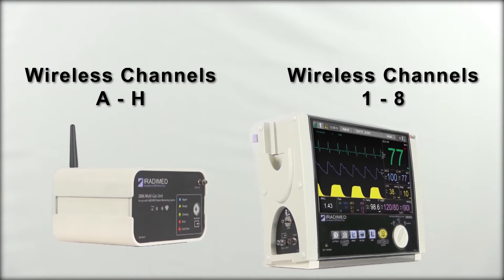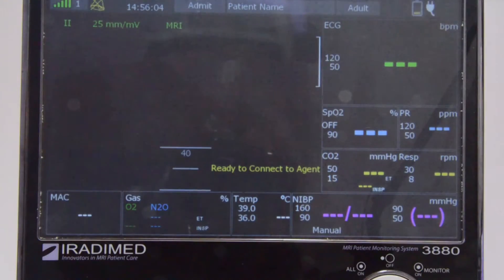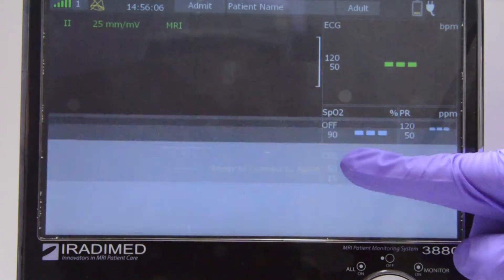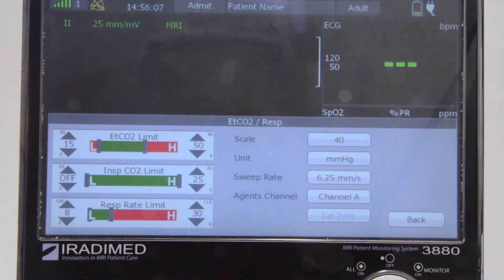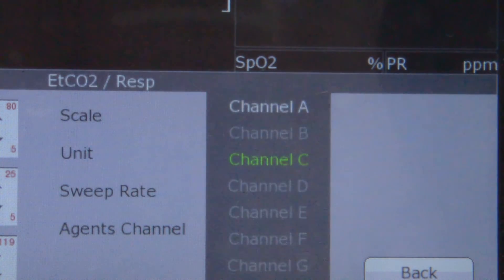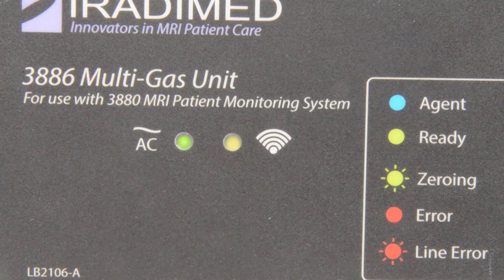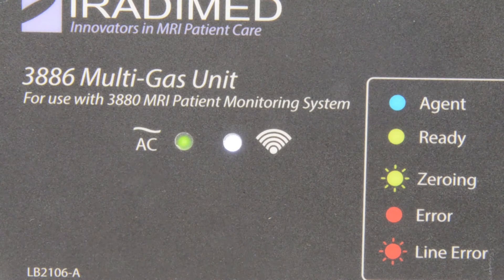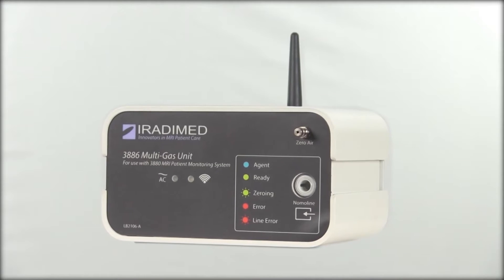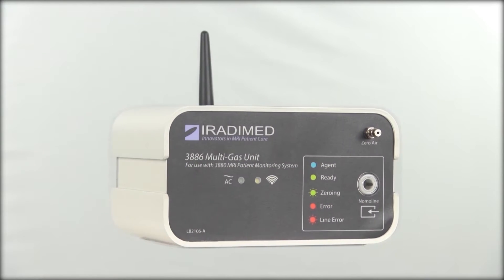To connect the 3886 to the 3880, the user will click the CO2 box on the 3880 monitor screen. Next, click the button next to agent's channel and select the desired channel. Once connected, the signal indicator light on the multi-gas module will illuminate to confirm connection. The multi-gas module is ready to have the NomaLine connected.